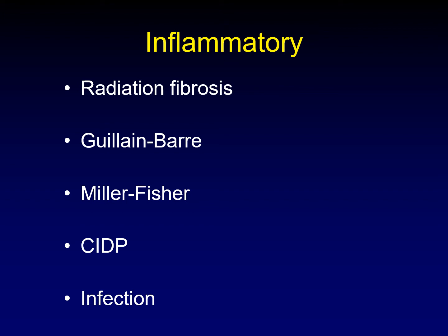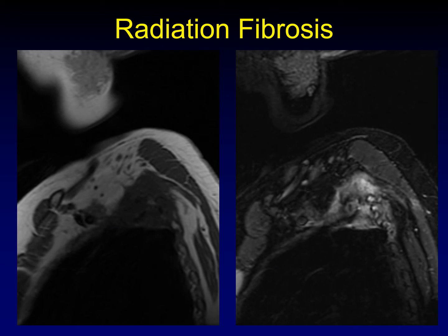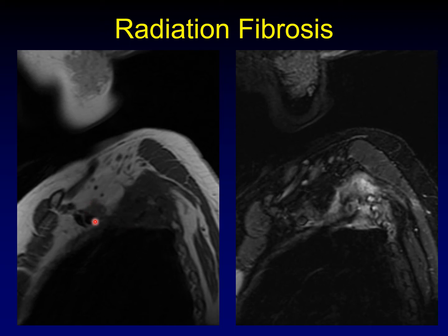Chronic inflammatory demyelinating polyneuropathy is another chronic disease that can cause enlargement of the nerves. And of course, infection — rare, but occasionally we get viral diseases. Let's talk about radiation fibrosis and how we distinguish radiation plexopathy from recurrent tumor. This particular example has both tumor and radiation fibrosis, so it nicely shows that distinction. Looking at the T1-weighted sequence, there is a large mass encasing some ribs and eroding through the chest wall, and also a smaller mass alongside the subclavian artery. One of these is tumor and one is radiation fibrosis — how are we going to tell them apart?